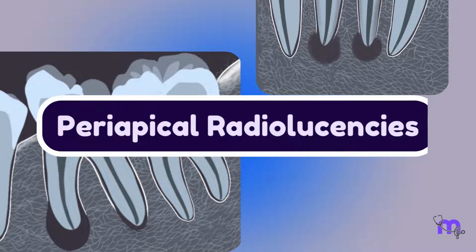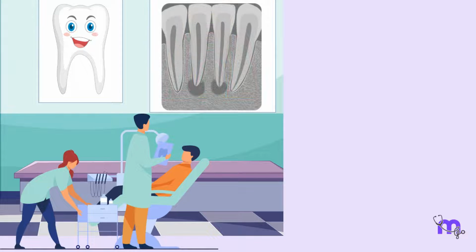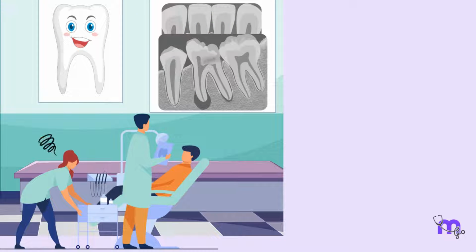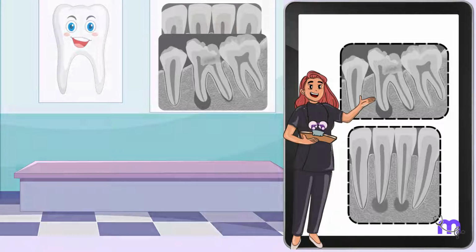Periapical radiolucency. During my practice, I saw many similar looking lesions on the radiograph, making diagnosis tricky. After years of clinical experience, I can now differentiate between these lesions.